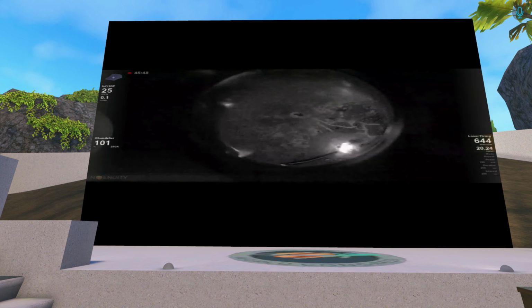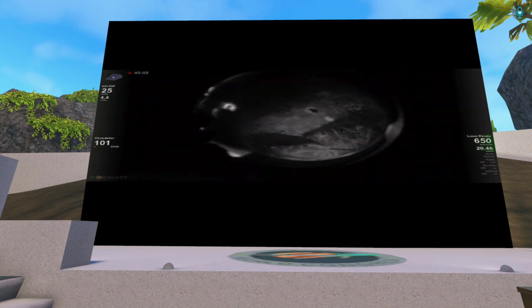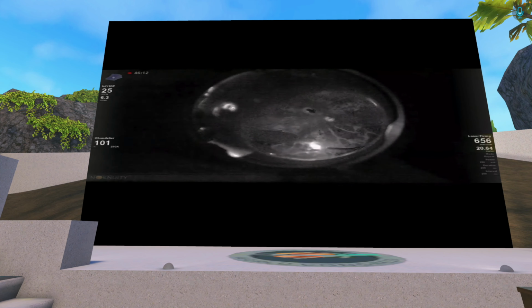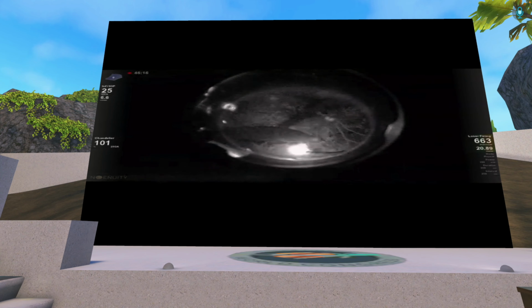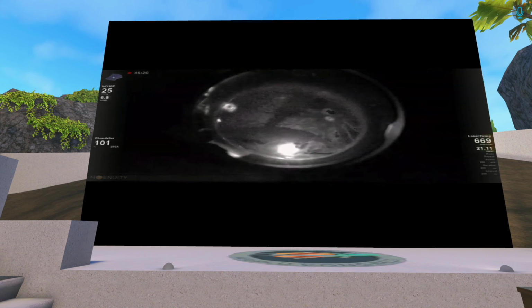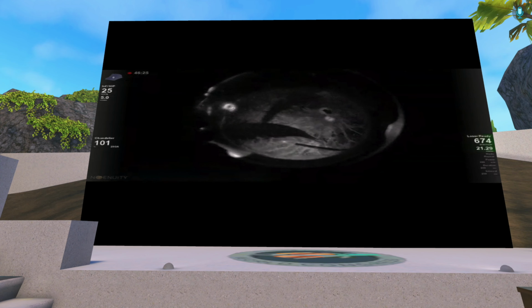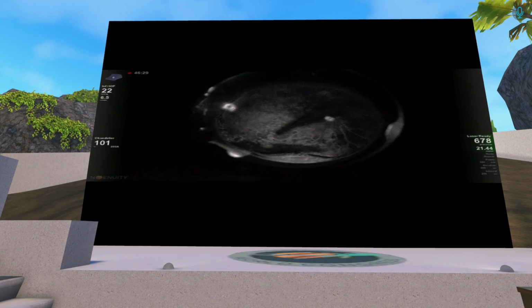And yeah, I'm trying to somehow treat all the areas. Of course I might miss something, but after I switched to the classical view, I was surprised to see how much healthy retina or unaffected retina was spared.